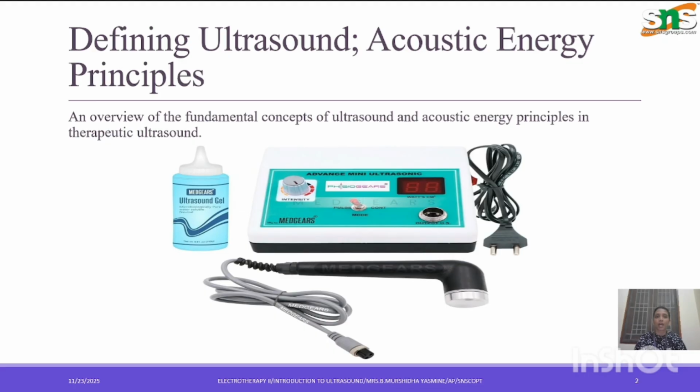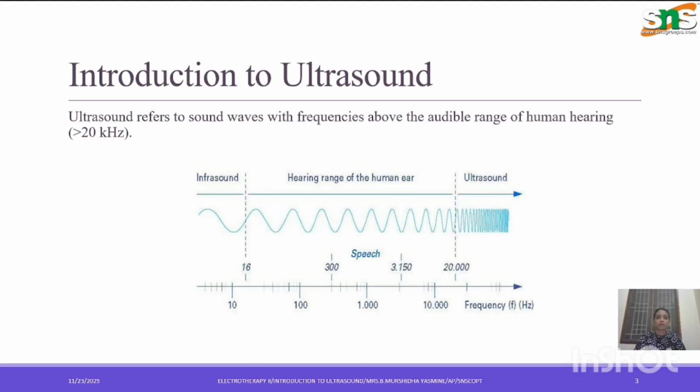Today's topic is about therapeutic ultrasound. In this video, you can understand the overview of the fundamental concept of ultrasound and the acoustic energy principles used in therapeutic ultrasound. This picture shows the advanced mini ultrasonic machine which is used for therapeutic purposes.